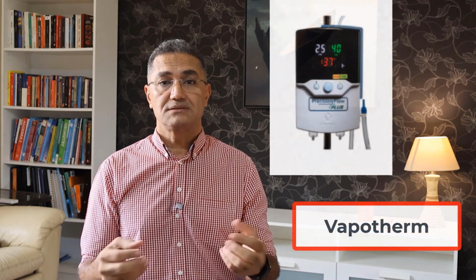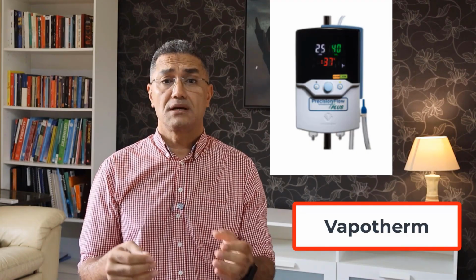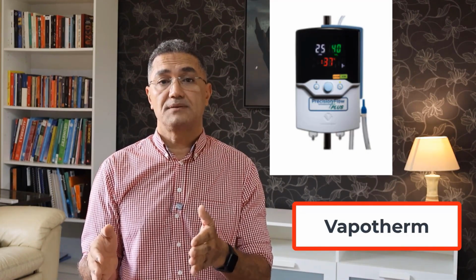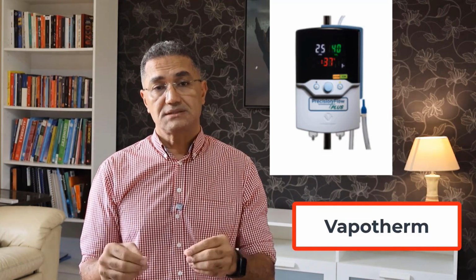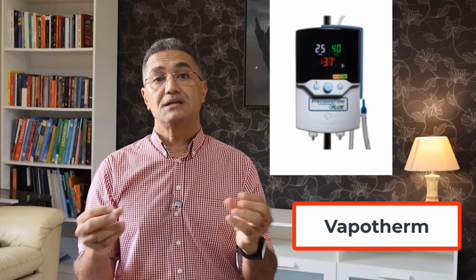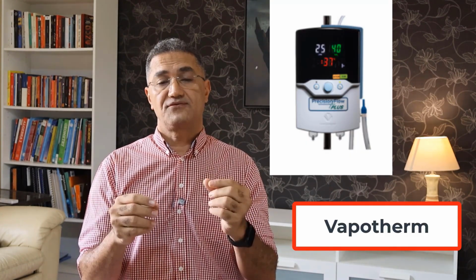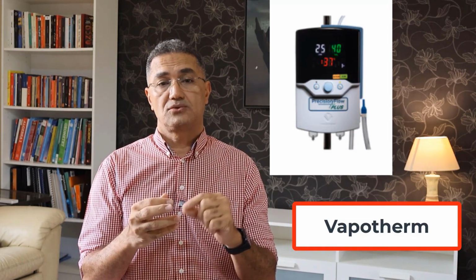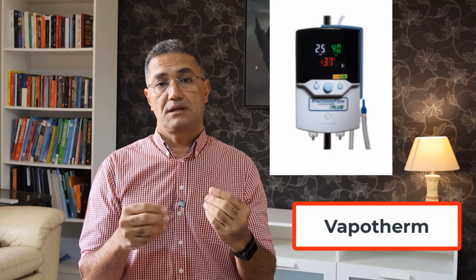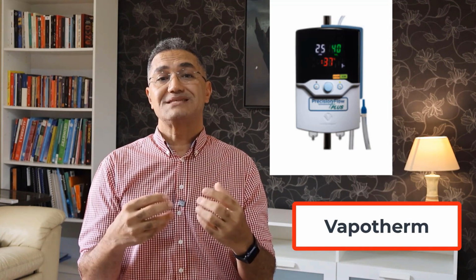We say this because the Vapotherm is a nasal cannula machine. What does it mean to be a nasal cannula machine? It means it delivers flow to the patient. As we mentioned, in neonates, it ranges from 1 liter up to 8 liters, and in pediatrics, it's 2 liters per kilogram per minute. This is the flow that comes out. So what's the story with the Vapotherm? It has a system that allows for the adjustment of both humidity and oxygen temperature, which is a very important feature. This is because we use it for patients who need oxygen therapy for a long period of time, such as those who are ill and require ongoing support.